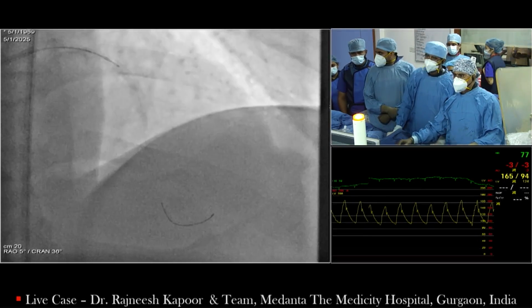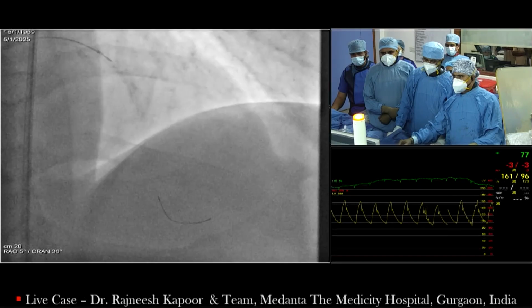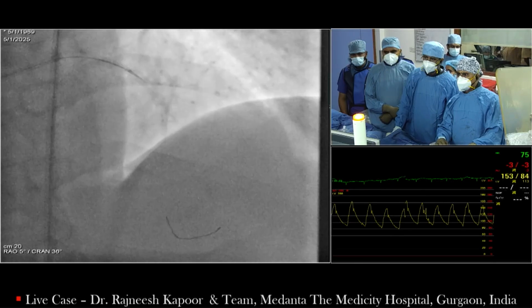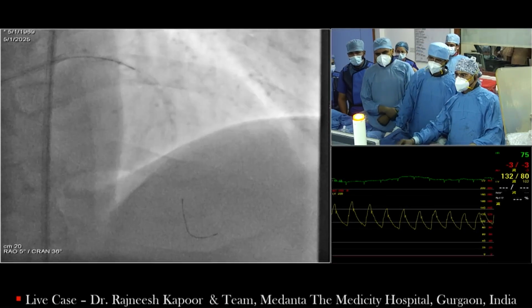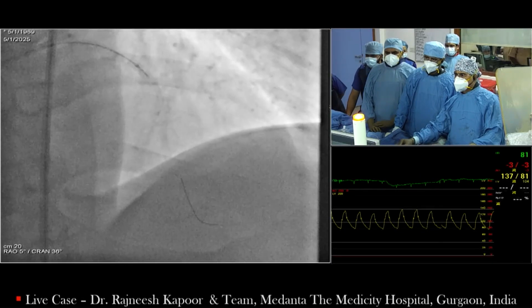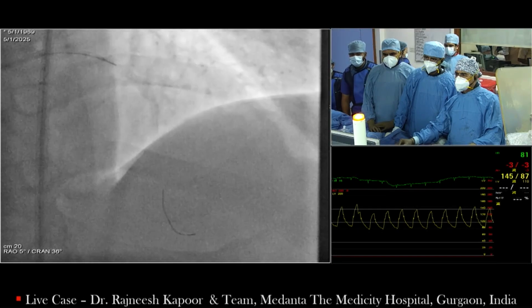I think guidelines will definitely impact a lot, from societies and at such meetings, when we discuss saying that it is okay to stop rather than trying to do ad hoc PCI without cardiac surgery backup. Even though in the SEAPORT trial, all of that has been proven, that it is all right to do in every situation. But maybe not, we can let Dr.